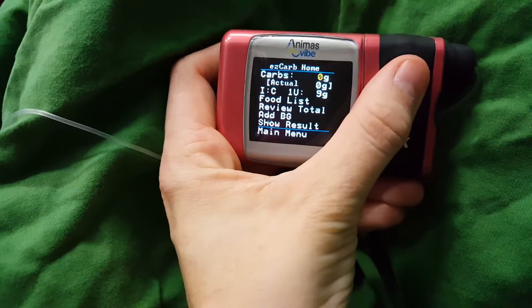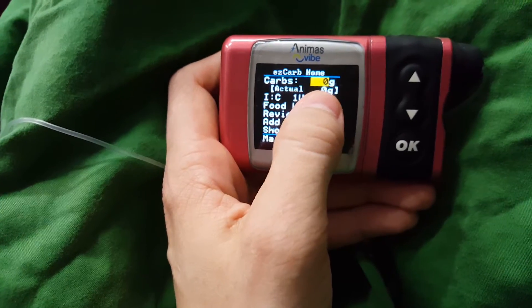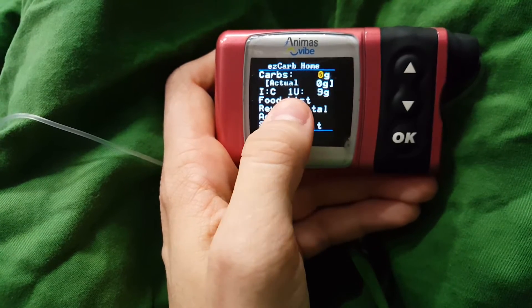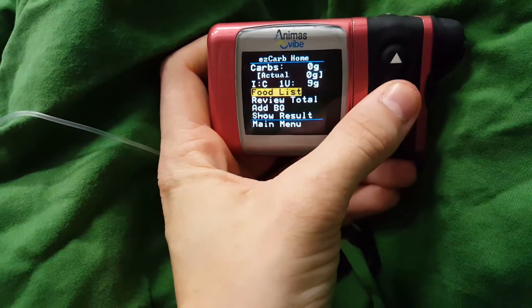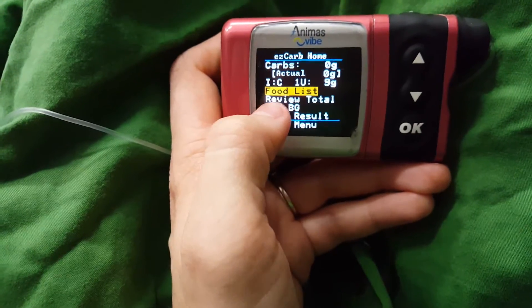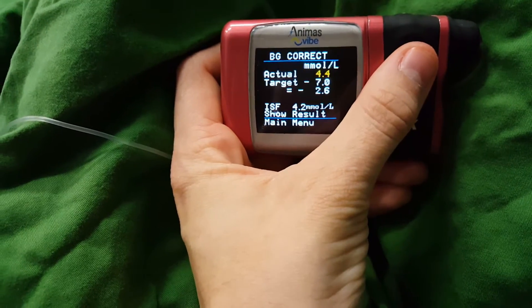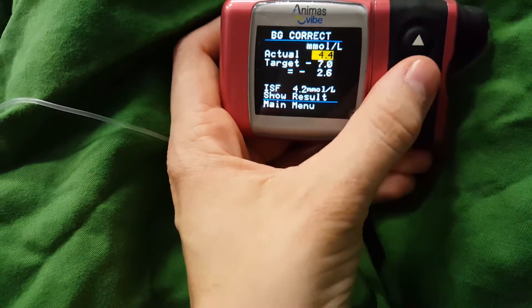Otherwise, you can do the easy carb, which you enter the amount of carbs you're about to eat. I think you can also set it up to put in the number of exchanges you have as well. This IC is insulin to carb ratio — so how much insulin for how many grams of carbs. Mine is one unit of insulin at the moment covers me for nine grams of carbs. You can also enter a food list of your favorite foods so that you don't have to keep entering the carbs — let's say an ice cream is 15 grams for instance. You can also review your total and add your glucose level in as well, which this is in millimoles.